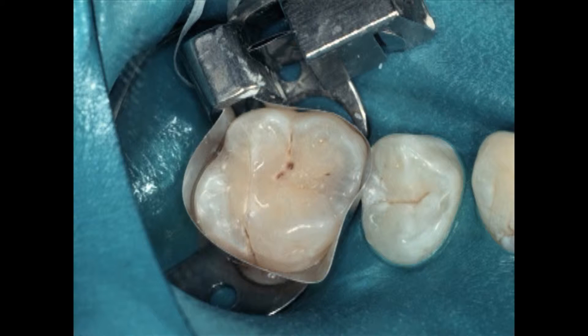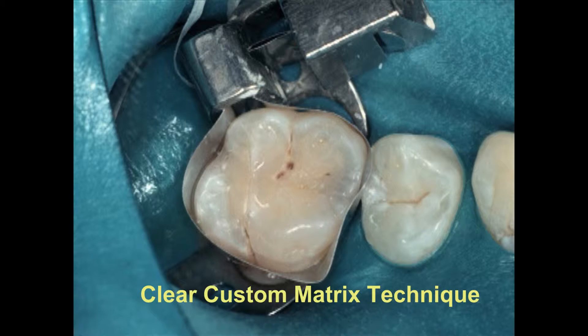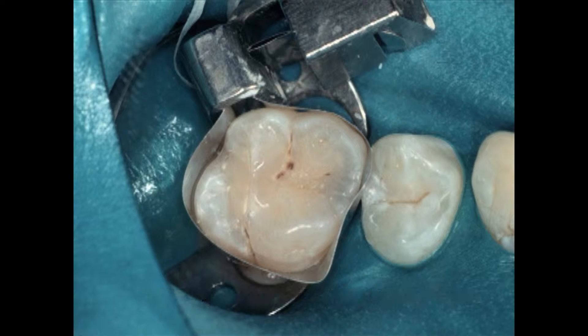This technique was originally developed for posterior composites. We have mesial caries on this first molar. The technique involves injecting the patient, getting local anesthesia — I almost routinely use a dam. While we're waiting for anesthesia to take effect, we put a matrix band around the tooth.